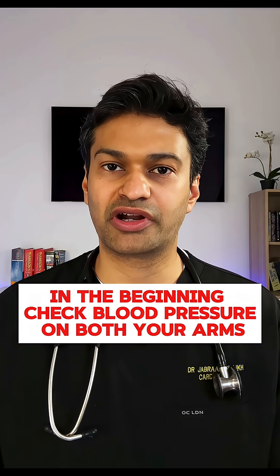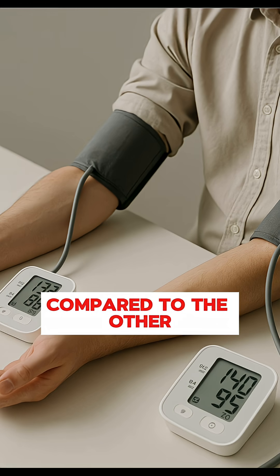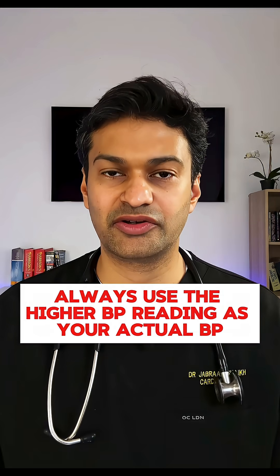In the beginning, check blood pressure on both your arms. You'll notice that one arm often gives you higher readings compared to the other. Always use the higher BP reading as your actual BP.